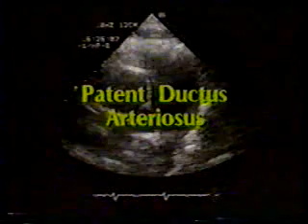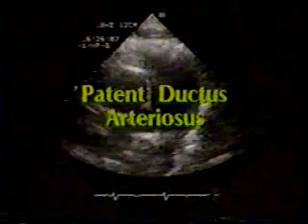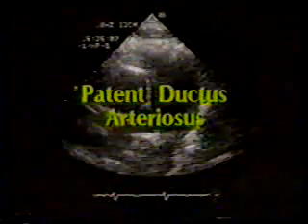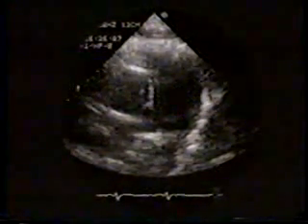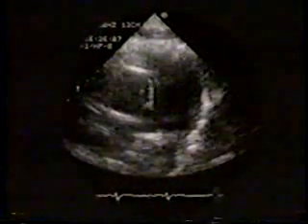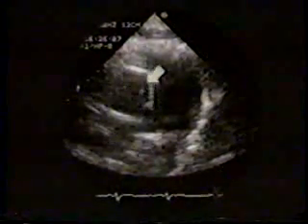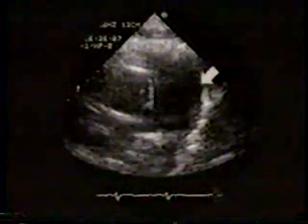Patent ductus arteriosus in adults is very infrequently encountered and is also extremely difficult to visualize by two-dimensional echocardiography. Color flow imaging is the method of choice for directly visualizing the shunt. This is a parasternal short axis view. Here is the aortic root, and here is the mildly dilated main pulmonary artery.